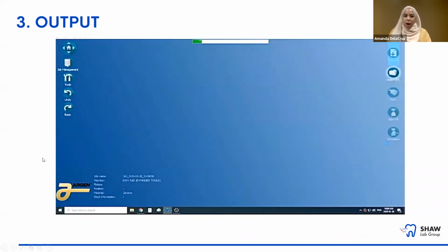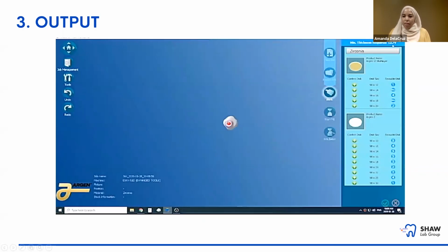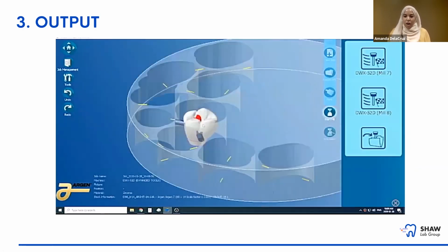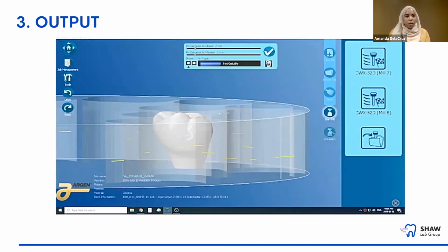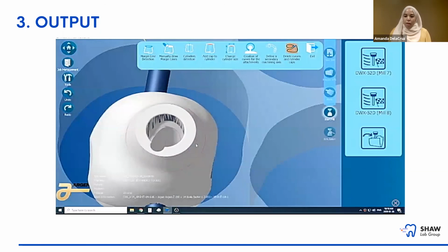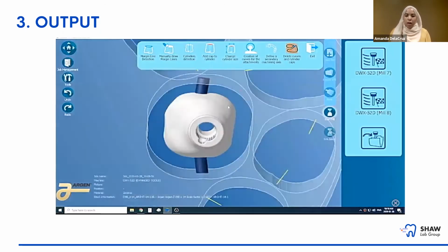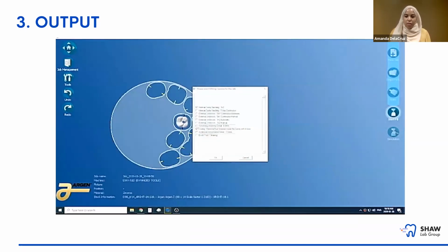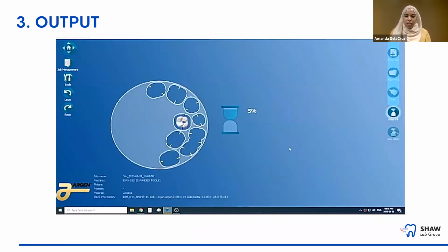We have the screw retained crown from the last video that we're putting in our CAM software, Millbox. And according to the information that we enter, the software will calculate how much bigger to mill the zirconia crown in order to account for shrinkage, as well as which burrs to use, when, how thick of a puck we should be using, and how long the machine is going to take to mill it. It's a very sensitive and intelligent process.